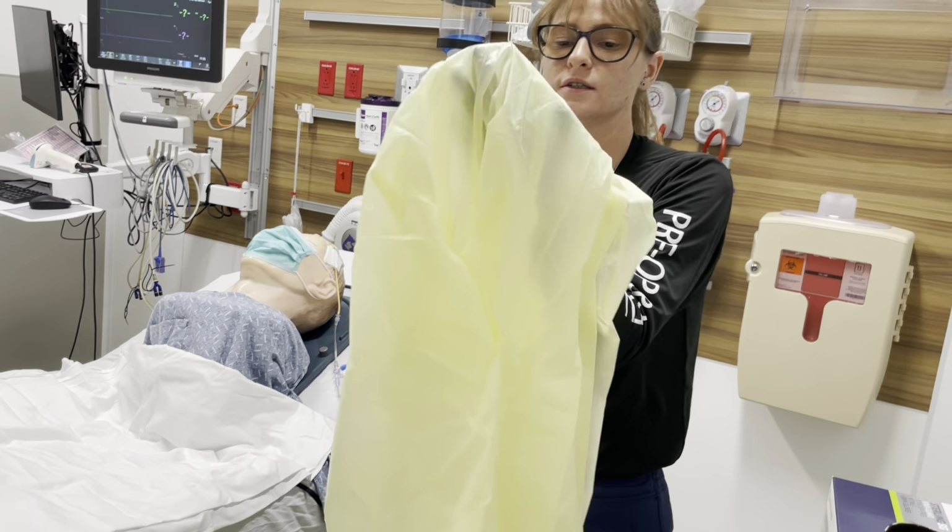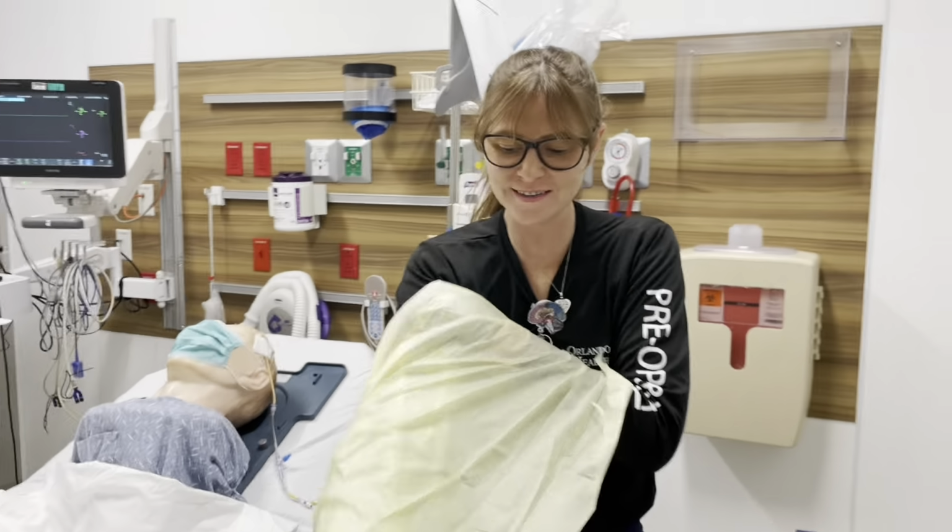You're gonna cut this so that way I just go into the gown? Yeah. If your gown wasn't all inside out.